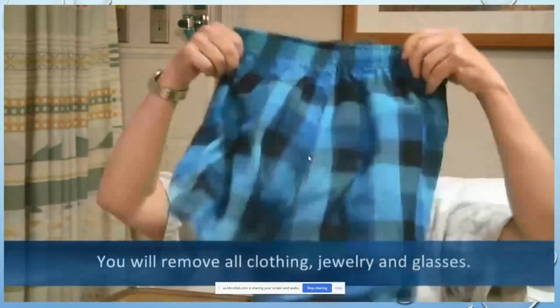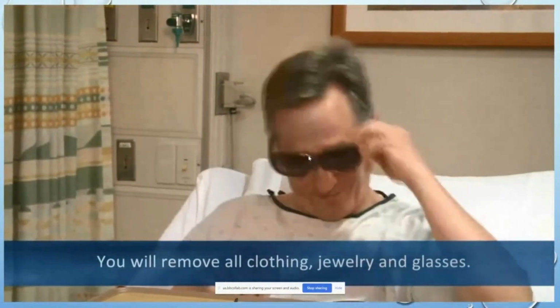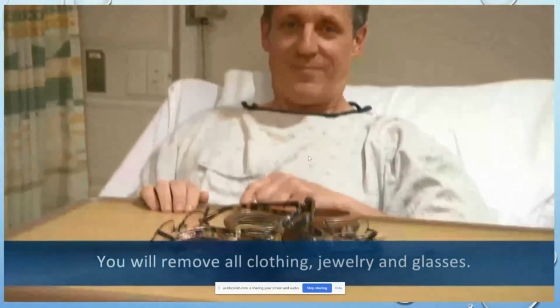You will be given a hospital gown, so please remove all of your clothes, including undergarments, jewelry, and glasses before going to the procedure.